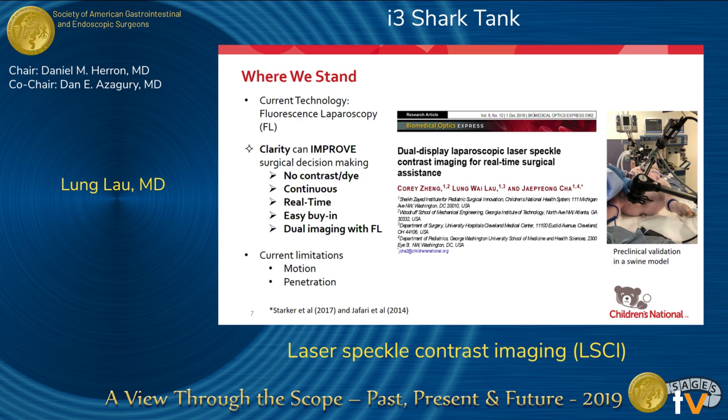We understand the importance of fluorescence imaging — ICG, for example, is valuable in identifying the bile duct. Our system can coexist with it. We use the same near-infrared sensor and light, so what we can provide is a method for presenting the fluorescence signal and laser speckle contrast imaging signal all together on one screen, giving you anatomy from a biliary standpoint as well as a perfusion standpoint.